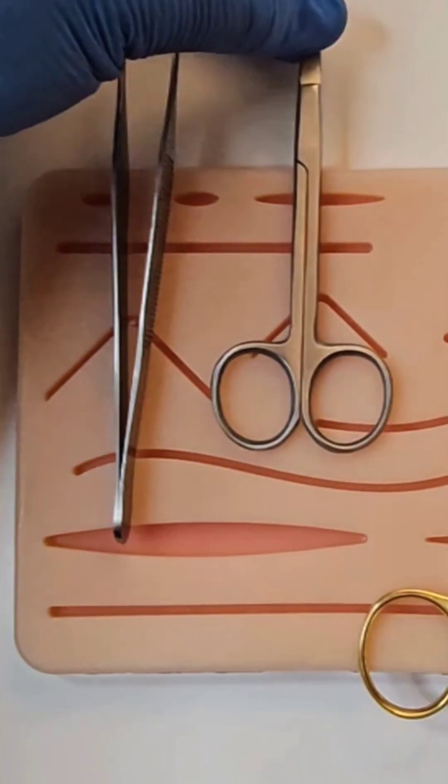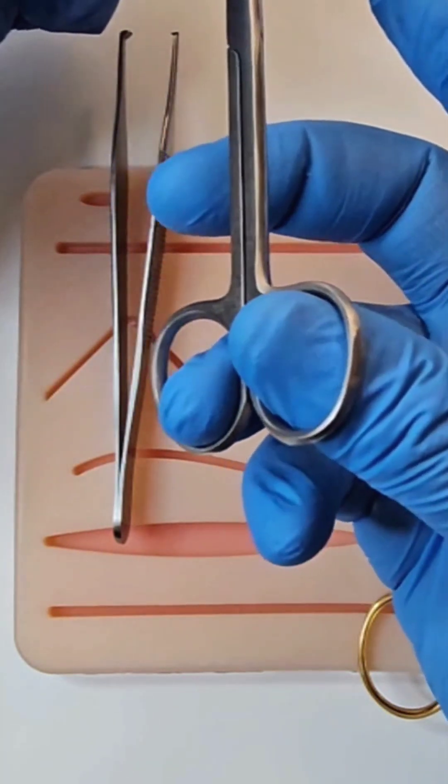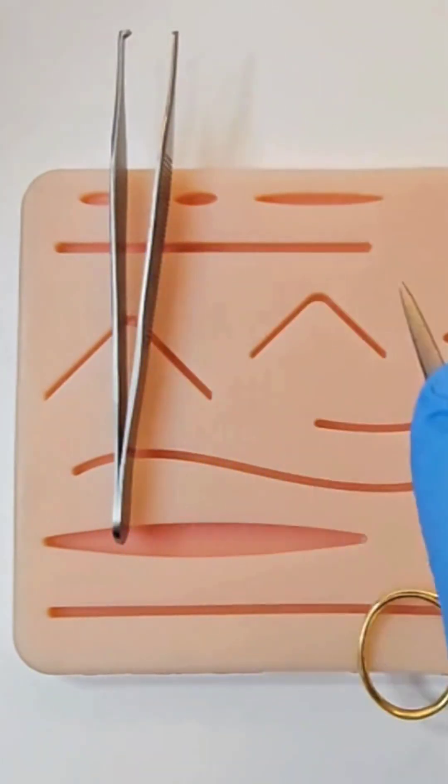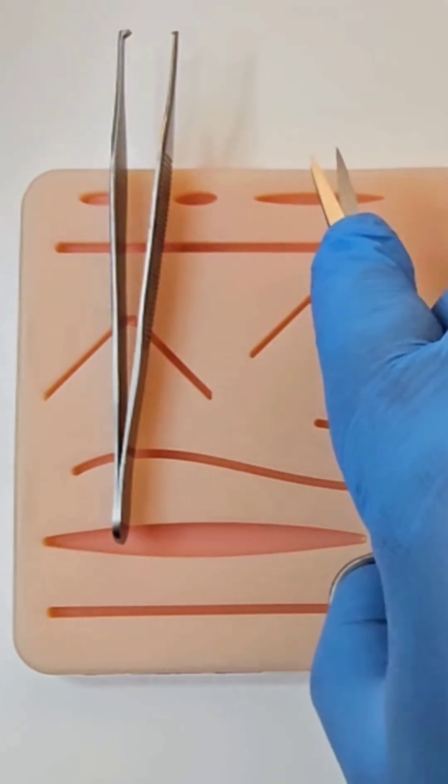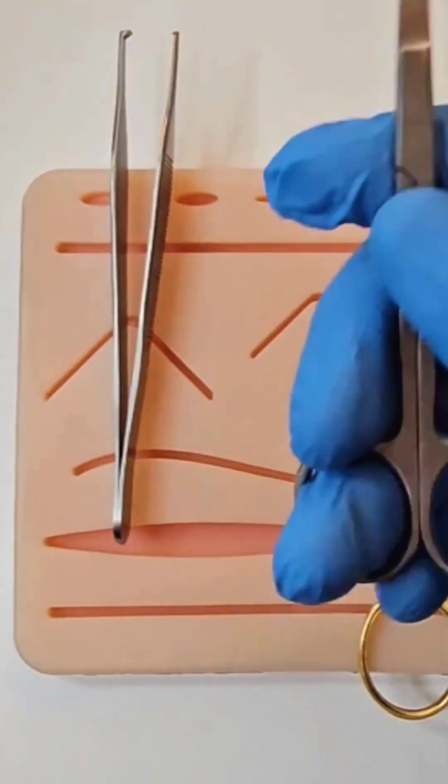The scissors you hold just like you do the needle holder: ring finger, thumb, middle finger on the angle, index finger along the body. Open the scissor, slide down the suture, and cut with the tips. These are typically right-handed instruments.